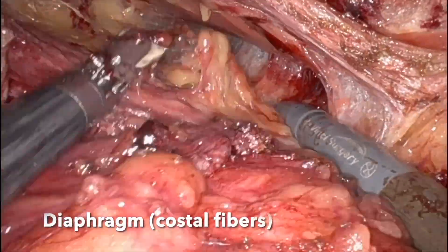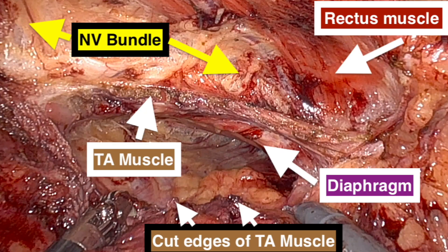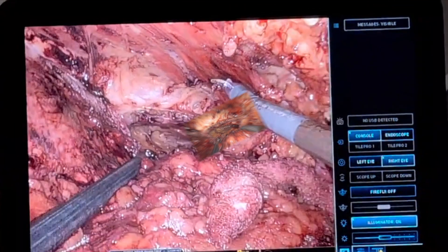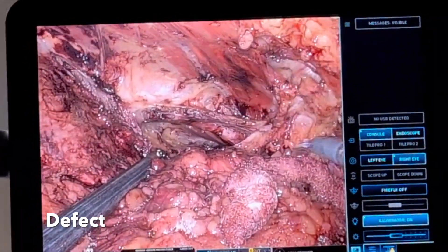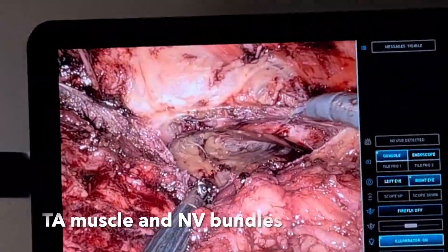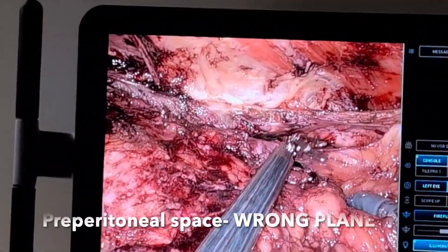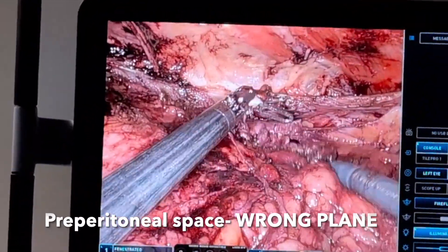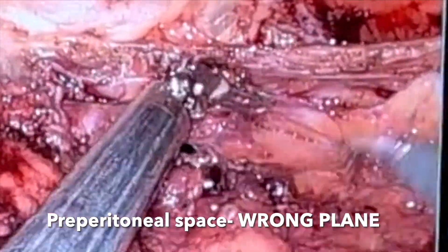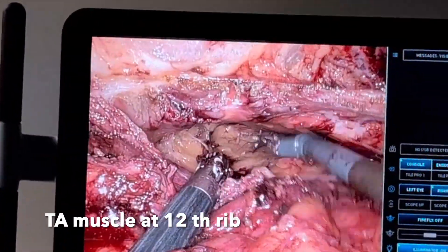We have entered the pre-transversalis plane, staying close to the muscle. Those are the costal fibres of the diaphragm. We can see the neurovascular bundles and the rectus muscle in the upper compartment, then the diaphragm and the cut edges of the transverse abdominus muscle. That is the defect, the rectus muscle on the roof, the transverse abdominus muscle, and the neurovascular bundles. That is the wrong plane to enter — staying close to the muscle is the trick, and the pre-transversalis plane is the right plane.